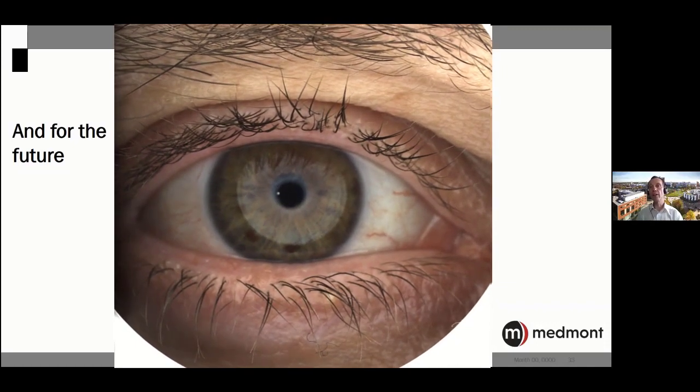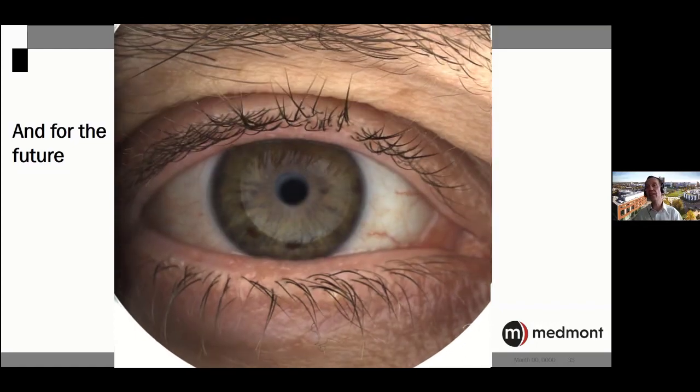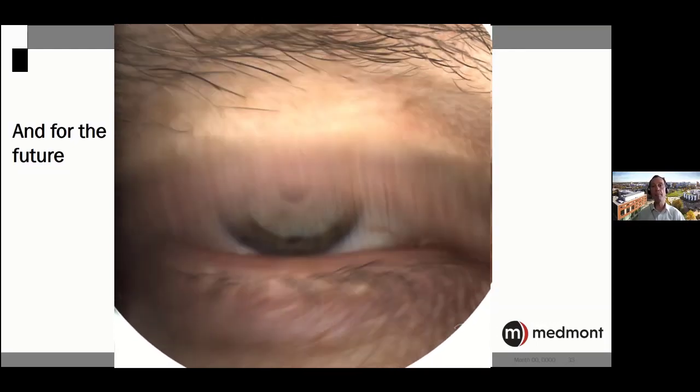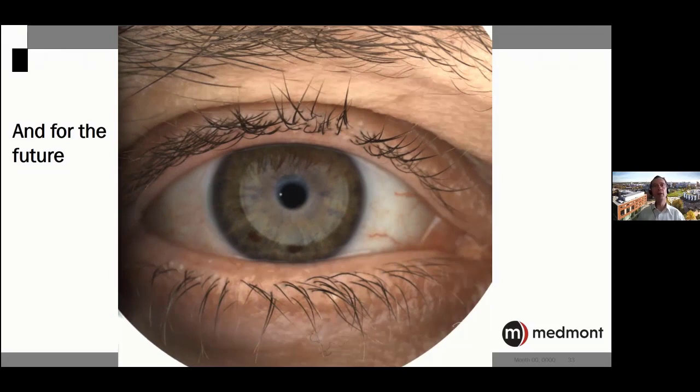And what's really nice about this is we're not just looking at a small inferior area to get that imaging. Actually, we can see the oils over the whole surface, or certainly the central 7 millimeters of the eye, in terms of the pattern that we're getting there. So again, really impressive technology with the imaging. Likewise, there are lots of controls where you can change the image in terms of light saturation, which light you use, the magnification that you choose to image over. And because it's a very high digital resolution image, you can take a central area out of it and still get exceptionally high imaging capability from that.